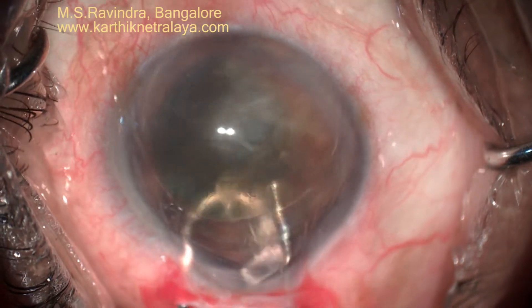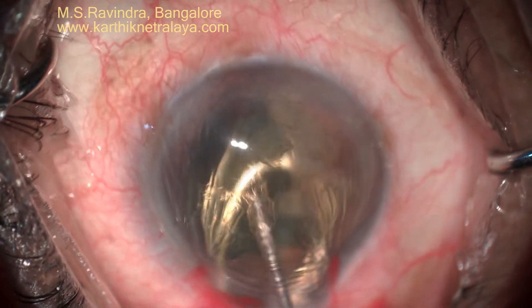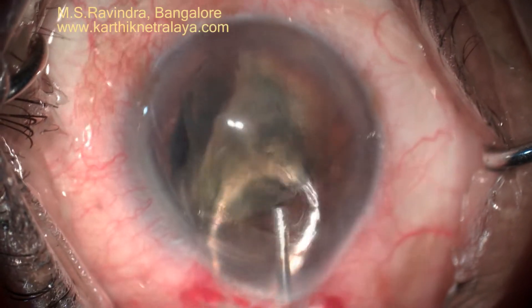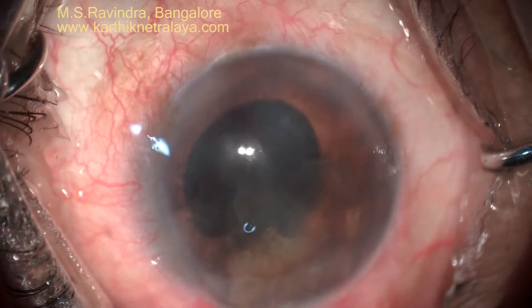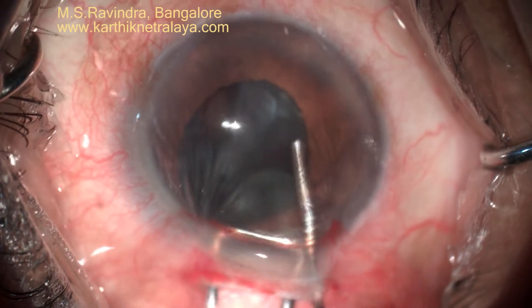The nucleus is rotated into the anterior chamber. There is no traction on the zonules at any point. It is bisected, and each hemi-nucleus is extracted from the eye by viscoexpression. It is supported and viscoelastic is injected in front, and the nucleus comes out by positive pressure and dragging of wire vectis.